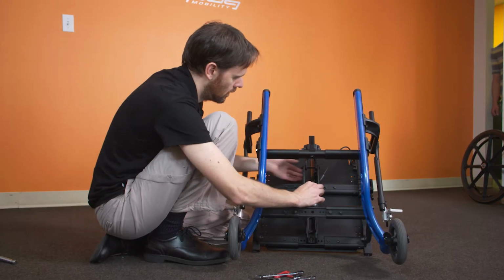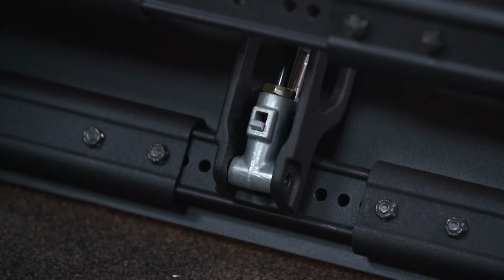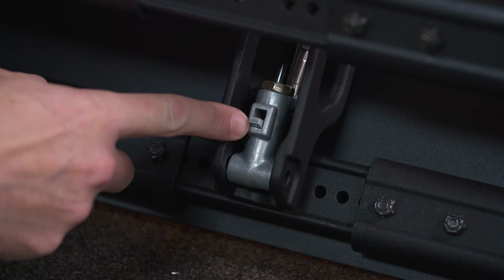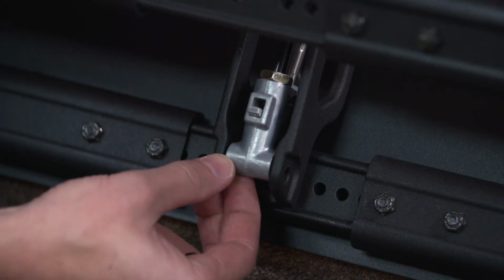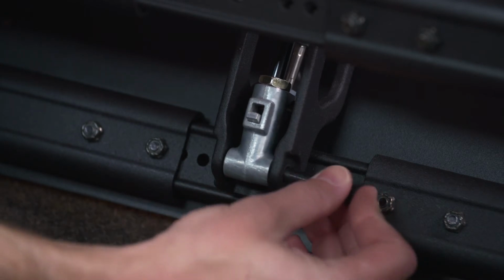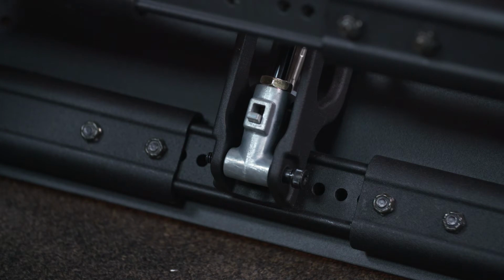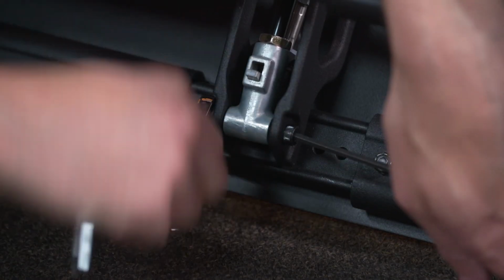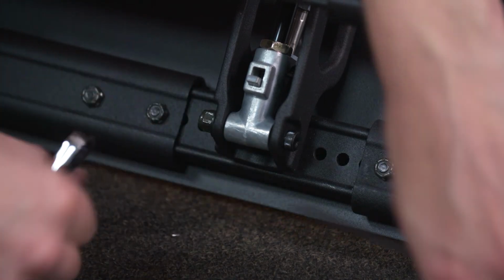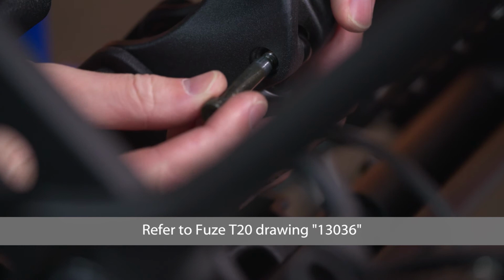Reinstall the fastener at the forward end of the strut. Tighten cable turnbuckle jam nut. Note the orientation of the strut end fitting. Reposition lower frame until fastener slides into place.